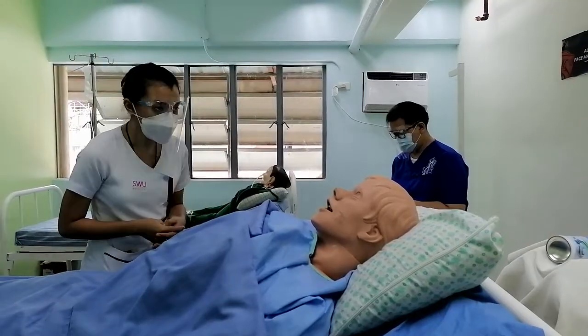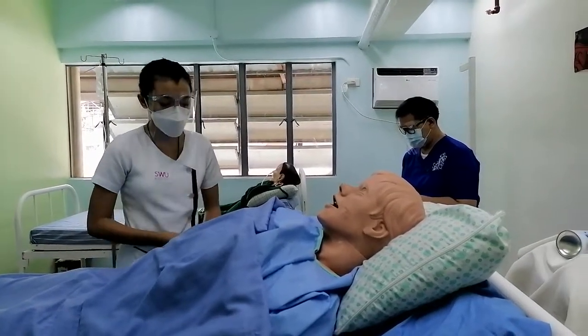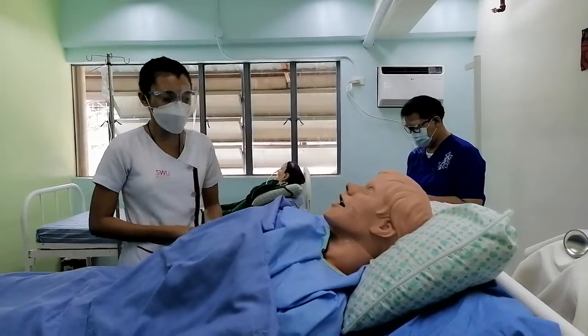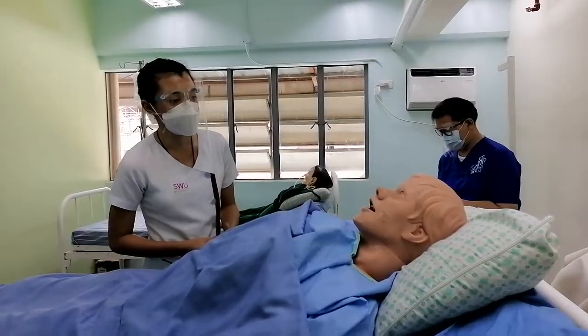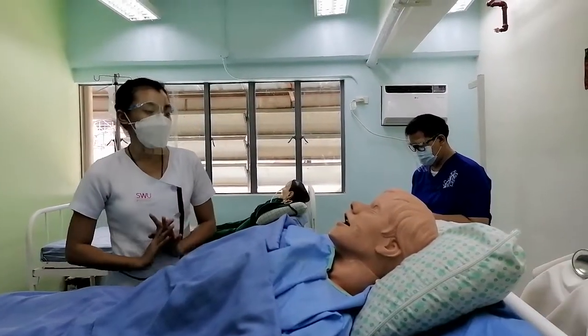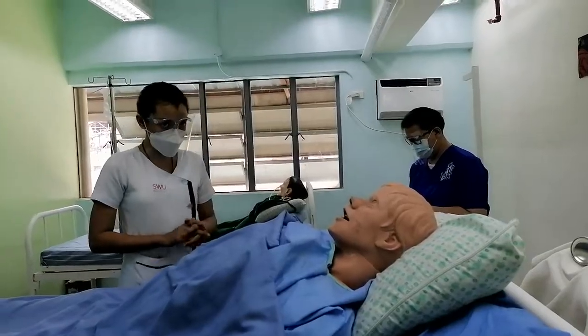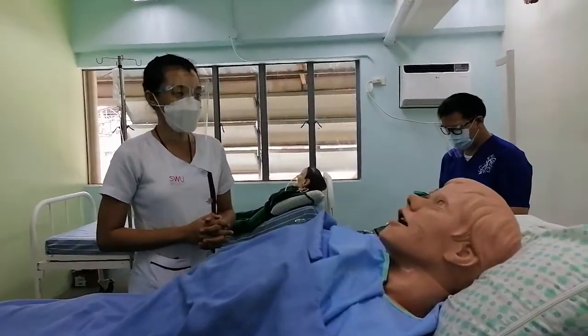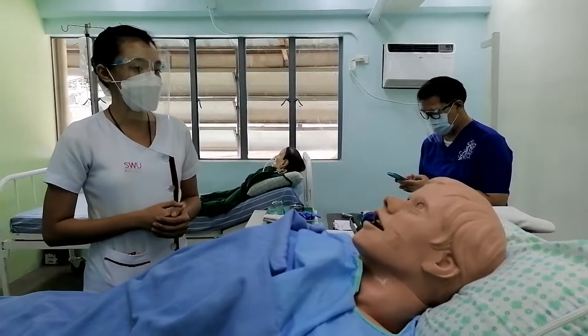And for the mental status, I will ask the patient: excuse me, sir, I am your nurse for today. Can I ask you a question? Where are you now and what is the day for today? So the patient is coherent. And then after determining the medical history, I will explain the procedure to the patient.